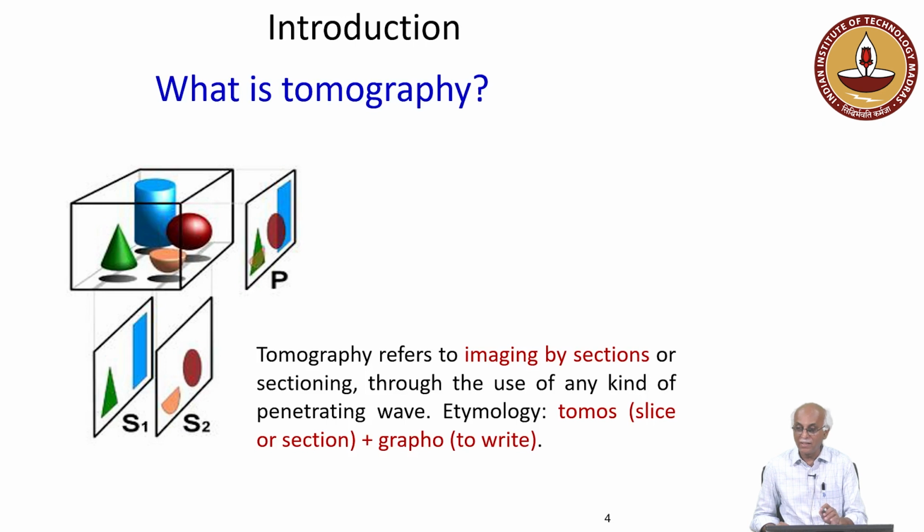So, let us say this is a box. Let us assume it is transparent to the optical part, within the visible range, for the time being, just to understand this, and it has various components in it.